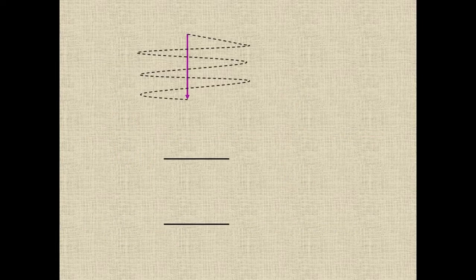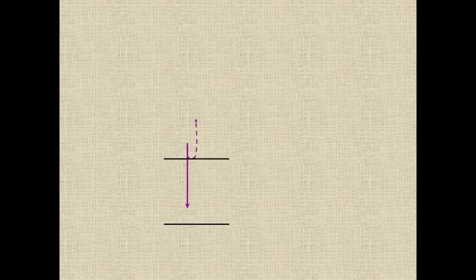The spatial pulse width is critical in axial or vertical resolution, and here we see a 3-burst ultrasound cycle with a fixed spatial pulse width approaching 2 different reflectors. As they approach the first reflector, some of the sound energy is reflected back, while the rest of the energy continues on to the second reflector. This is likewise reflected back, and what we have is 2 returning echoes separated by a gap, which means the ultrasound machine can resolve these as 2 different structures.